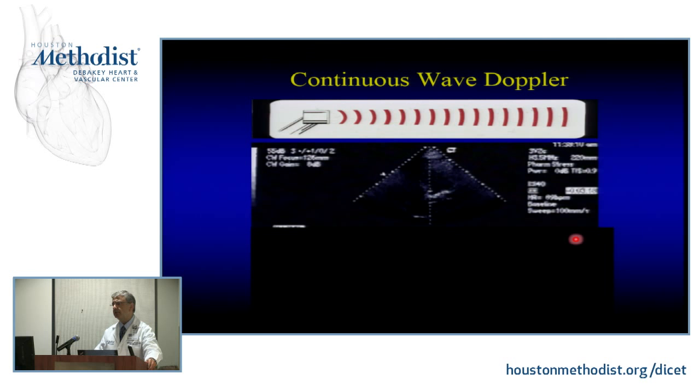This is continuous wave Doppler. So basically, from the same transducer, I'm sending continuously. It's no longer bursts or packets, sending continuously and receiving continuously, so that I'm not limited anymore with stroboscopic light. It is ambient continuous light. So now I can see, meaning I can resolve velocity. But I'm resolving these velocities along a certain scan line. And anything goes. It's like superimposing your image to that in the back, to that in the back, anything goes.